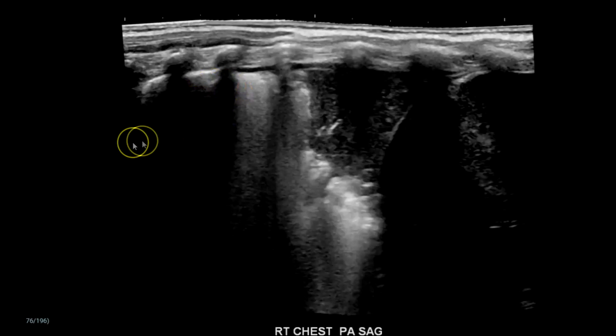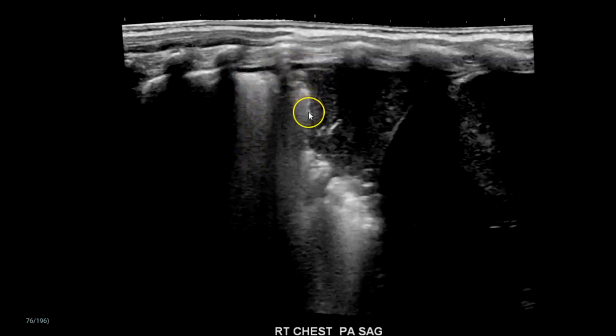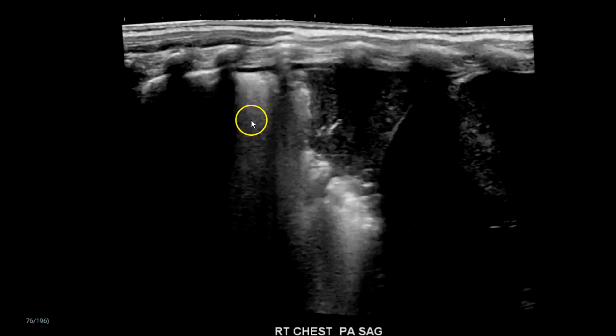And here's a panoramic of the right. You can see the pleural line, and then you can see where there's some pleural effusion and that haziness, and then this consolidated part right here with the diaphragm. I hope you find this useful. Take care.